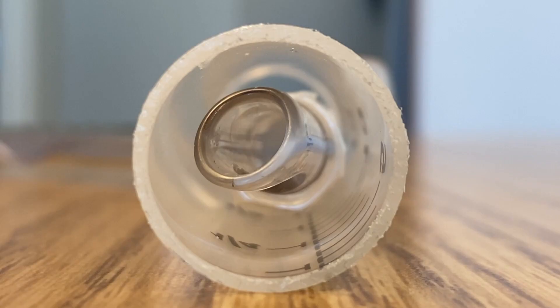Here's what happens when a cuff is overinflated. This is 10 cc's of air in a syringe that's about the size of an adult trachea.